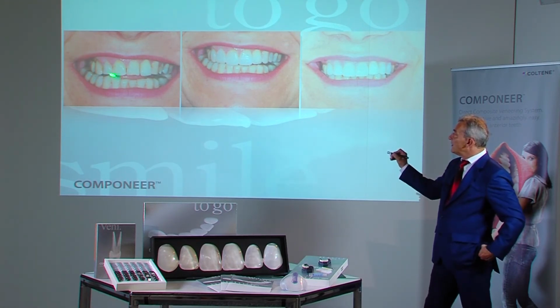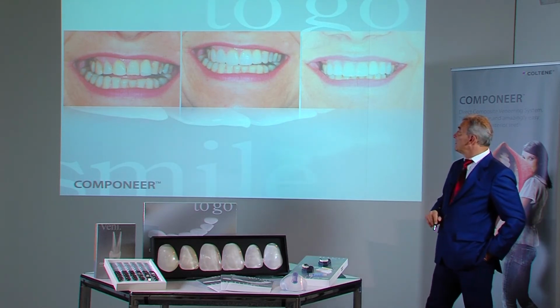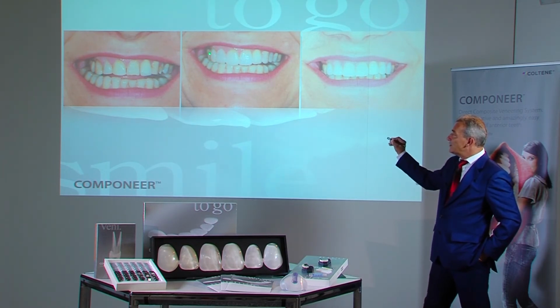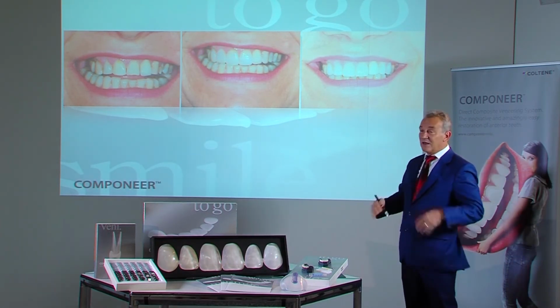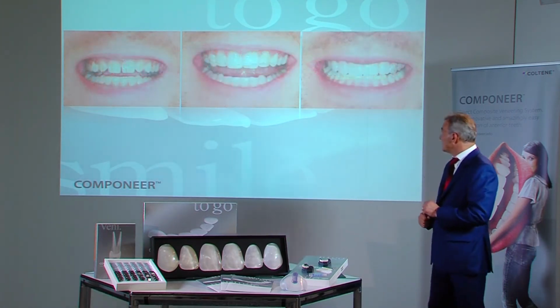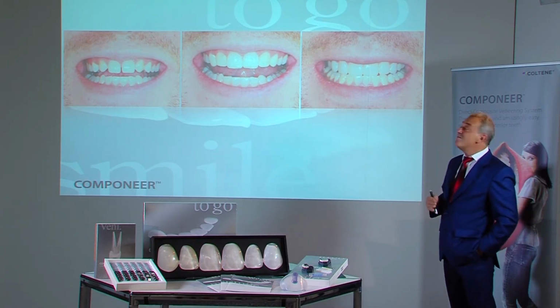And again, we have this unpleasant contrast line. It cannot be changed completely, as this would also require some modifications to the mandible. Therefore, this line is lifted slightly to finally change the contrast line. This is relatively difficult here, as we're dealing with a crossbite. Nonetheless, even with this crossbite, the upper teeth can be arranged somewhat buccally and so improve the optical situation. It's important that the final result should actually always look better than the diagnosis.